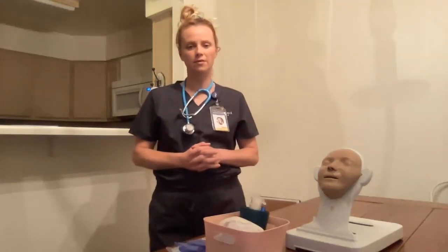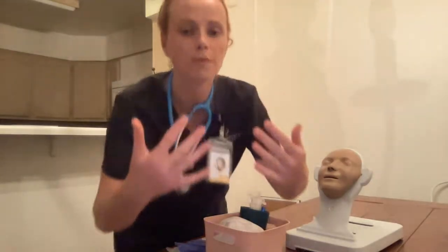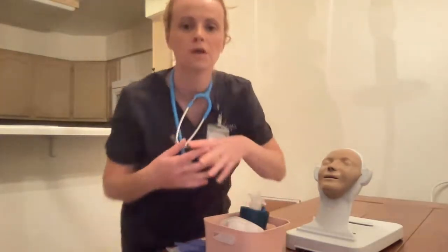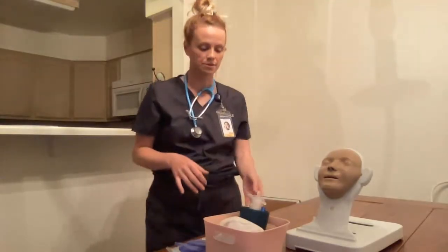I'm going to perform the skill video NG tube insertion. I'm in the appropriate school attire, badge is visible, no polish, no acrylic nails, no jewelry. Alright, to start off, I will go check my physician's orders regarding the NG tube insertion.